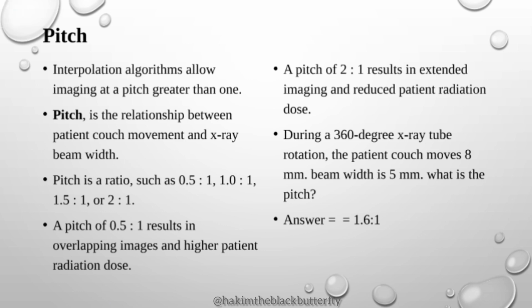Okay, that is interpolation. The CT creates slices of anatomy, but the slices may not have enough information because maybe during scanning there is some data that is missing.